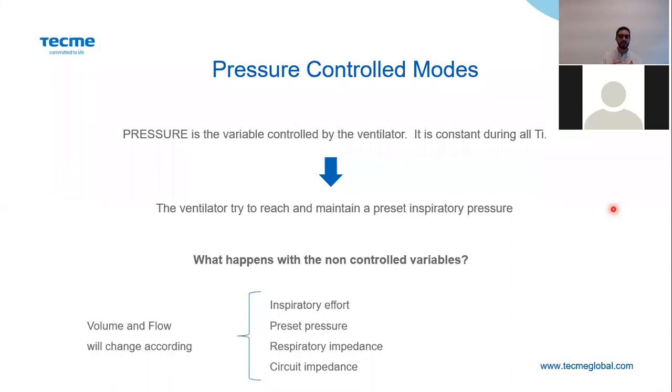They will change according to the patient's inspiratory effort, according to the preset pressure, and according to the respiratory impedance. That means according to the compliance or the resistance, and according to the patient's circuit characteristics.